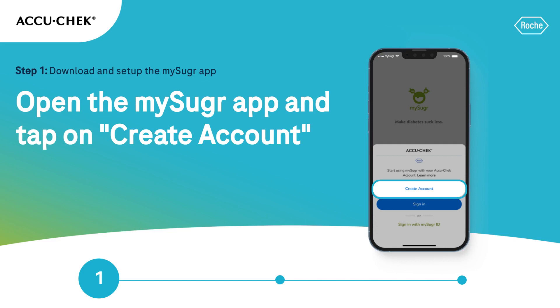Let's start the process with the first step of three. Once you have downloaded the app, you are ready to create an account. Open the MySugar app and tap on Create Account.